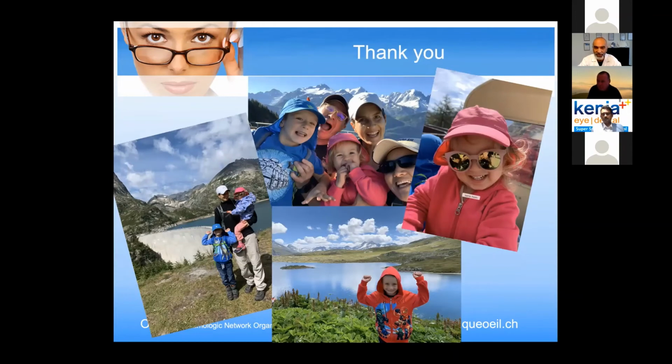Before the time, we collect some questions over there. Just some highlights of what you just mentioned. You used the word easygoing for this type of lens, and I think that's really it. This is what we get from feedback: if you tilt it or decentrate it a little bit, it's still much more tolerant than other lenses, especially those that have rings on them, and that's one of the key things. The fact that you have this aspheric in the middle, and then the platform of monofocal, you can even decentrate or tilt it a little bit and still have a good result, which is not the case even for our add-on, for example, which contains rings. That's very important as well.